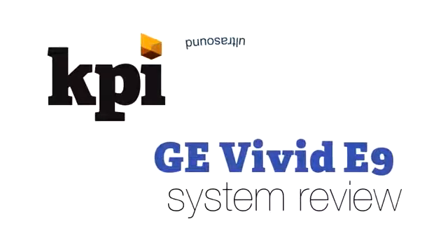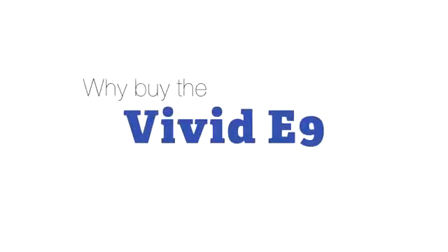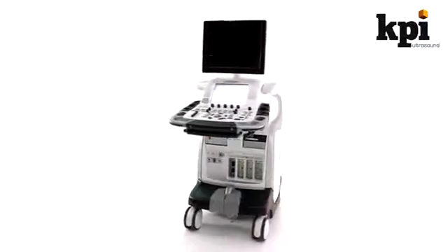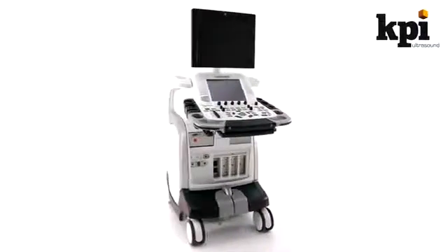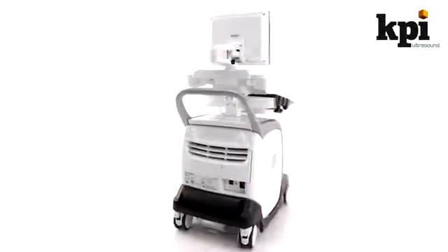The GE Vivid E9 System Review. Why buy the Vivid E9? The Vivid E9 is a top-of-the-line cardiac ultrasound machine with deep cardiac 4D tools and next-generation hardware that will go a step beyond the Vivid 7 Dimension and put it on par with the Philips IE33.